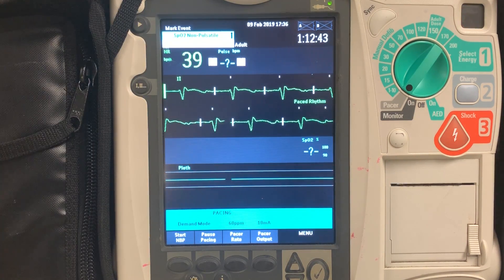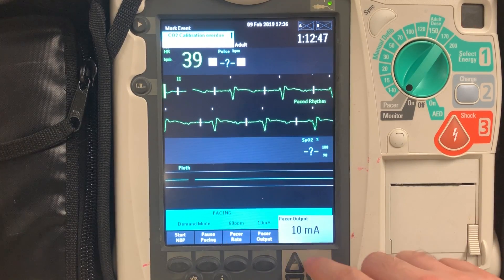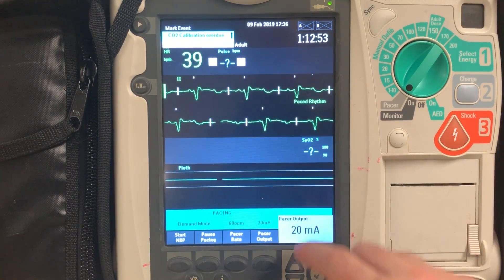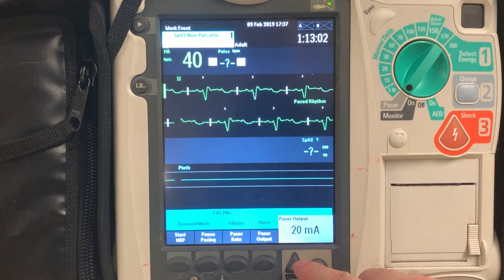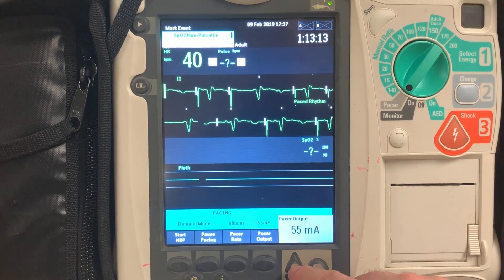How do you know you have electrical capture? You know you have electrical capture when you have increased your milliamps to the point that you have a pacer spike followed by a QRS, which is followed by a broad, tall T-wave. So we want to see a pacer spike, wide QRS, followed by a broad, tall T-wave. We're going to slowly increase our milliamps — that's the amount of energy you're delivering to the patient — until you see that pattern on your EKG monitor.